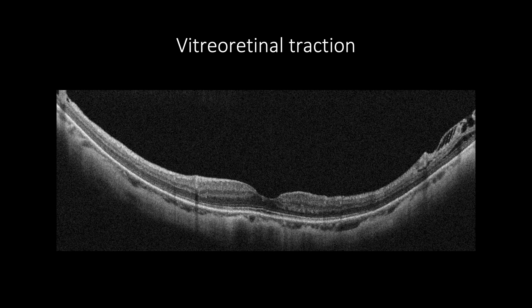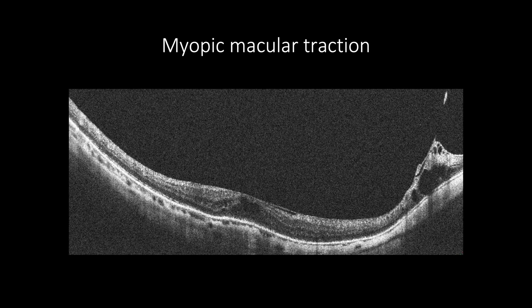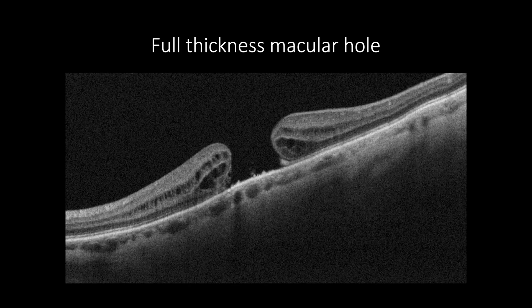OCT is the tool of choice to diagnose vitreoretinal abnormalities, such as epiretinal membrane, which appears as a hyper-reflective band causing traction at the arcade or at the center of the macula, causing myopic traction maculopathy, leading to cystoid macular changes mostly in the inner retinal layers, and tubular forms inducing schisis, and in severe cases, lamellar or full-thickness macular holes.